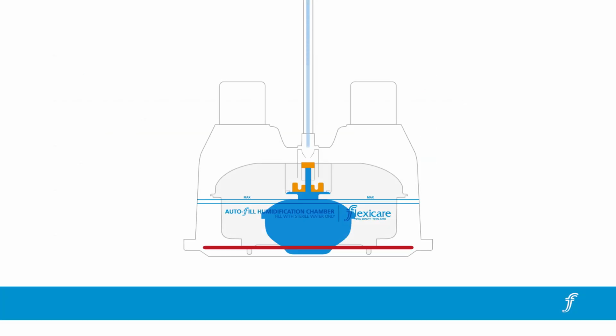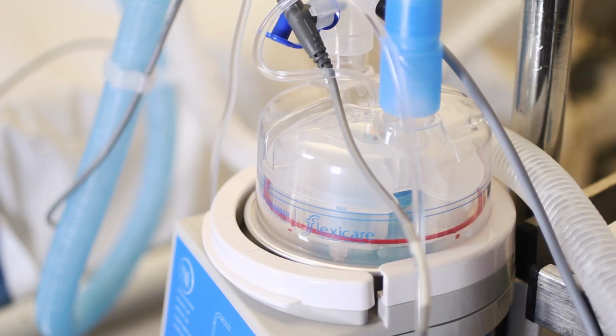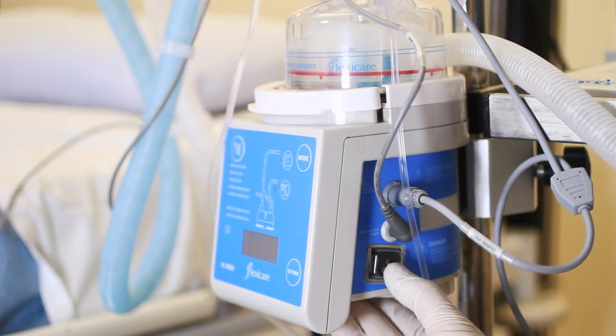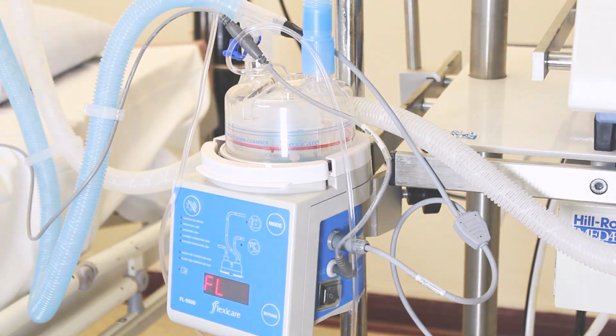Once functional testing is complete, open the pinch clamp and allow the sterile water to flow into the humidification chamber. Only when the chamber contains water and respiratory gases are flowing through the breathing system should the FL9000 respiratory humidifier heater be turned on, selecting the appropriate mode and settings.